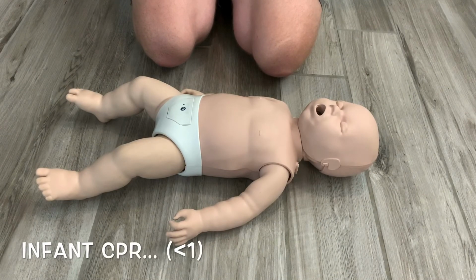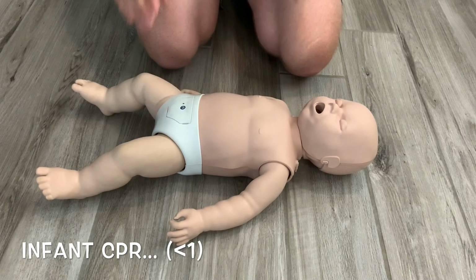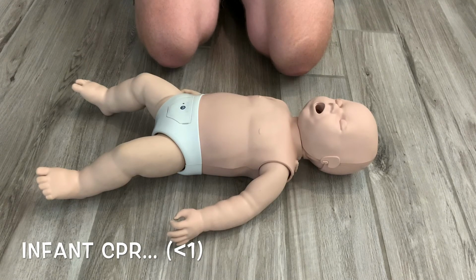Here are the differences when performing CPR for an infant or somebody under the age of 1. We still want to check responsiveness. Hey, are you okay? Hey, are you okay? We then want to tell somebody to call 911 and get an AED. Call 911, get an AED.